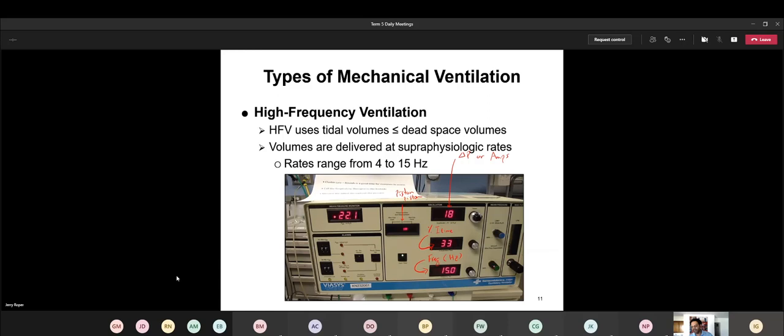If you adjust your bias flow this way, then you may have to change this, which is just called the bias flow. It looks kind of like a flow meter, and that's essentially all it is. There's our little floating ball that represents how many liters per minute of flow. In most cases, you're usually going to start around 20 liters per minute of bias flow.